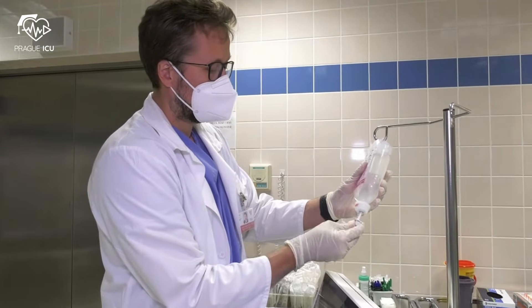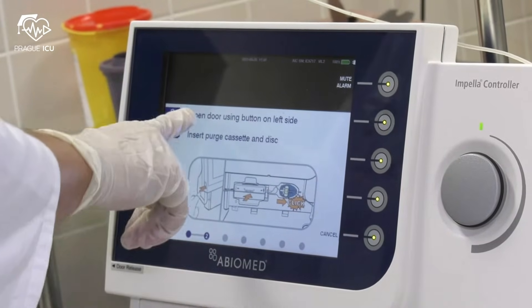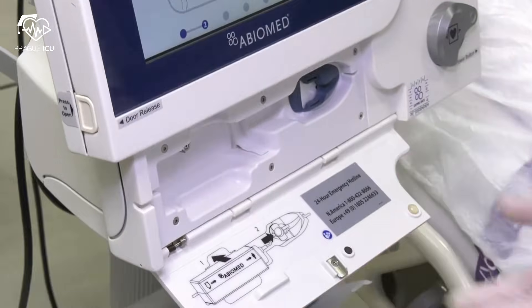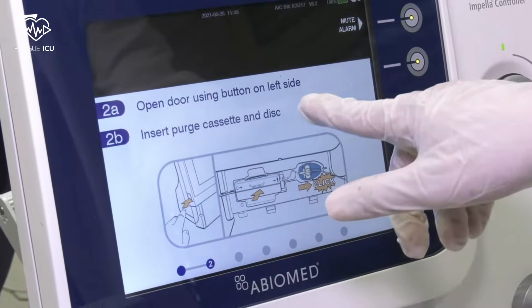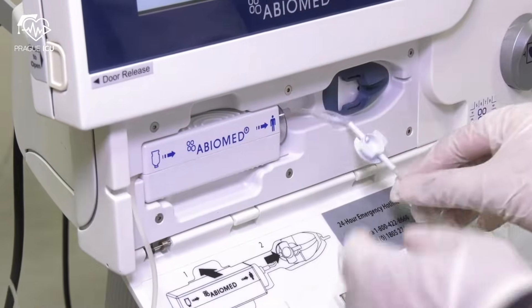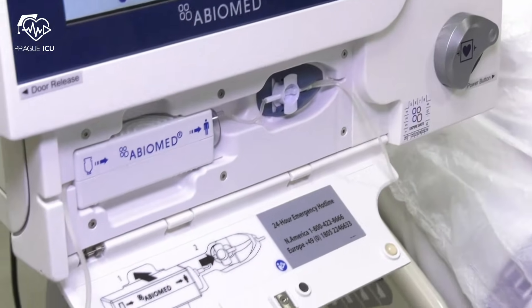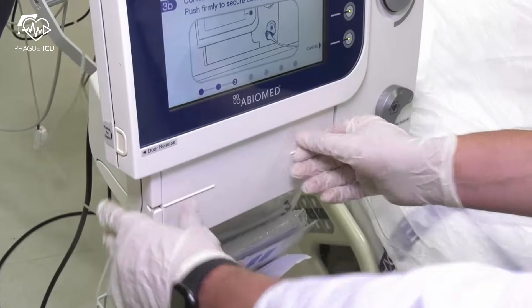First, spike the dextrose bag — we recommend 5% glucose with 25 units per milliliter of heparin. Then press next. Now open the door using the button on the left side and insert the purge cassette and purge disc. Close the door without kinking the tubing.